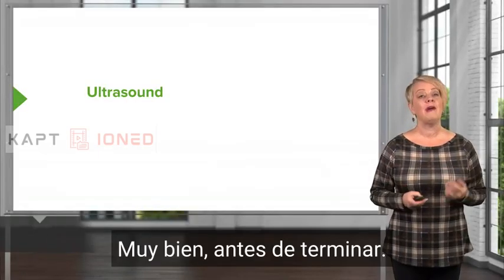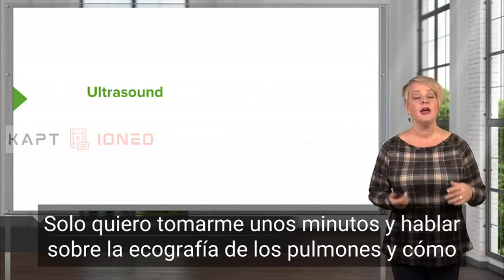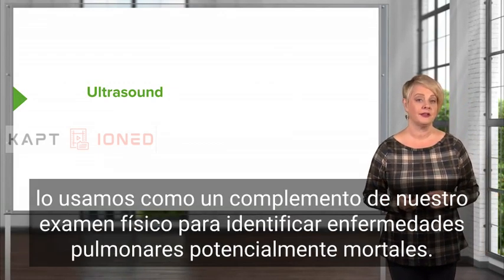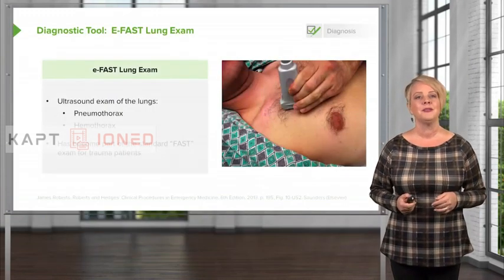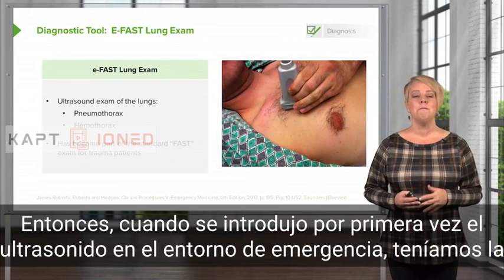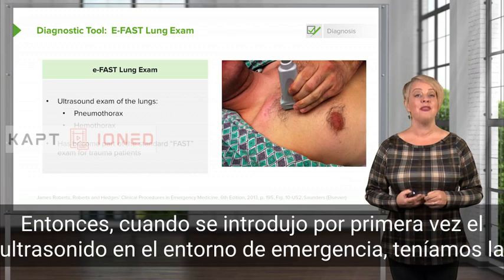All right, before we wrap up, I just want to take a few minutes and talk about ultrasound of the lungs and how we use that as an adjunct to our physical exam to identify life-threatening pulmonary injuries at the bedside. So back when ultrasound in the emergency setting was first introduced, we had the FAST exam.